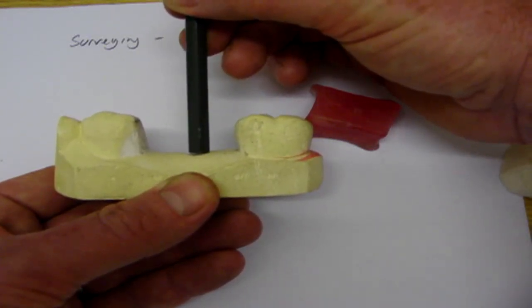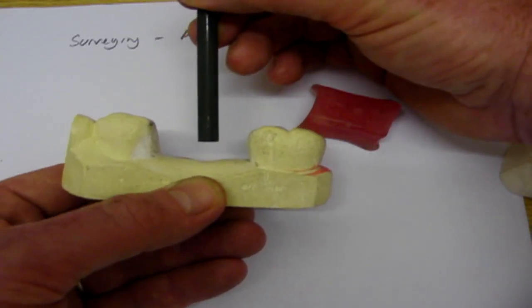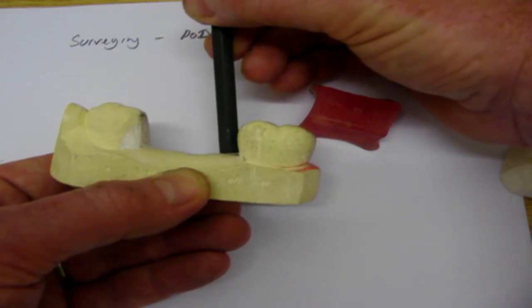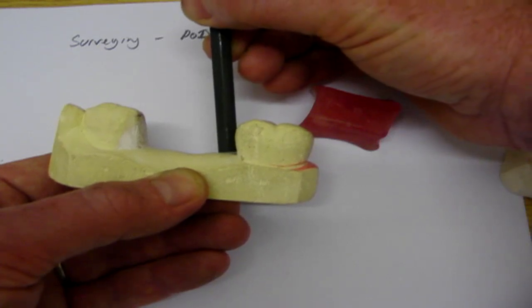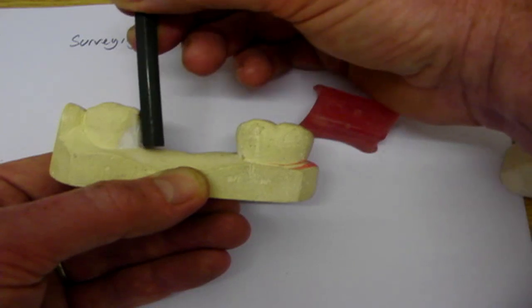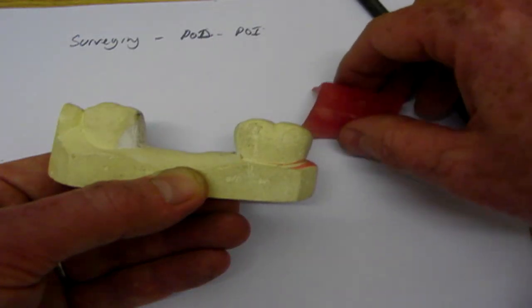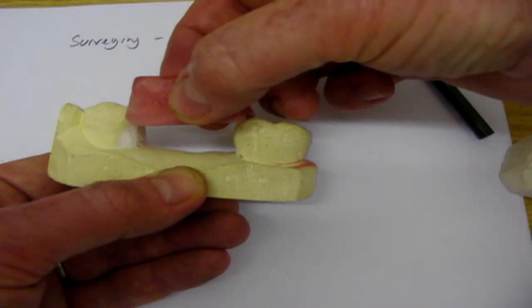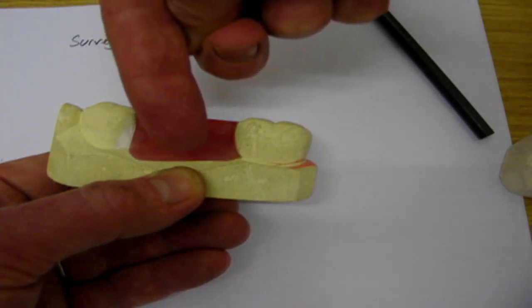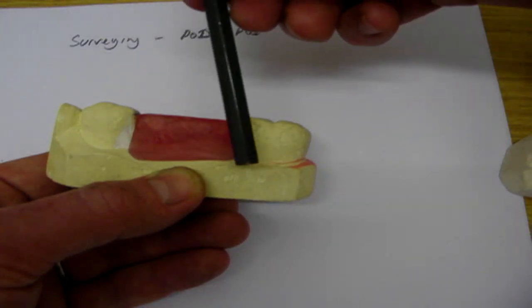If you decide to make a path of insertion such that the denture needs to engage this undercut, the model gets tilted on the surveyor until the surveyor arm fits snugly down the mesial aspect of the molar, and then the undercut relative to that path of insertion gets blocked out on the other tooth. Now we make the denture such that it slots in along the path of insertion, so it's going in that direction. The denture drops in that direction so it engages this undercut.